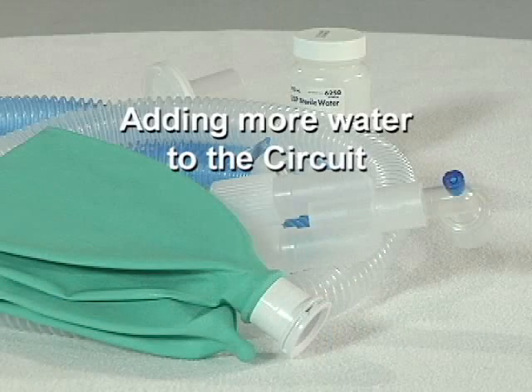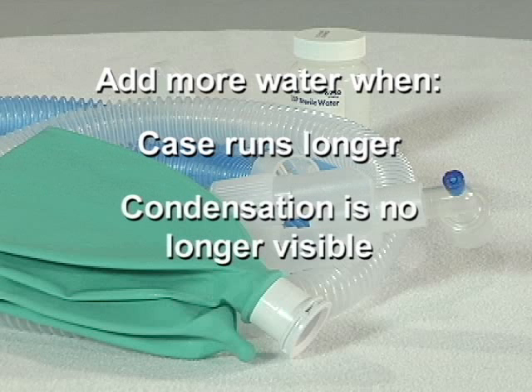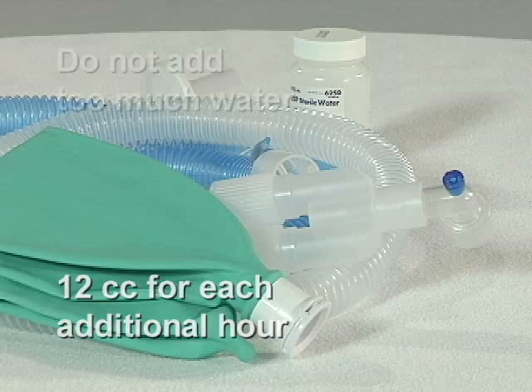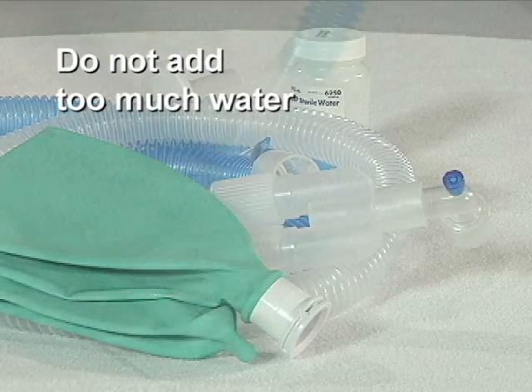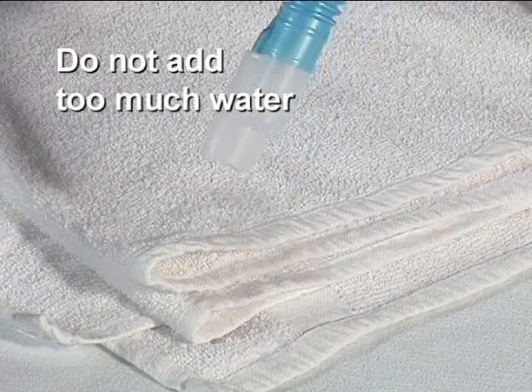Adding more water to the circuit. If the case runs longer or condensation is no longer visible within the inspiratory tubing, add more water. Add approximately 12 cc of water for each additional hour of humidity. Do not add too much water. If you overfill the circuit, simply drain excess water out at the end of the tube.